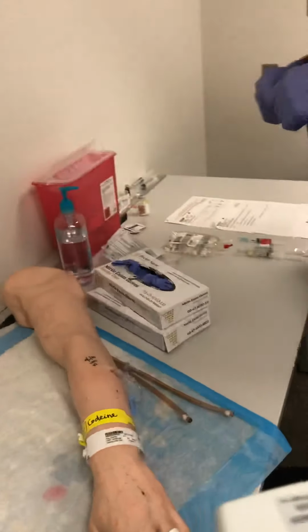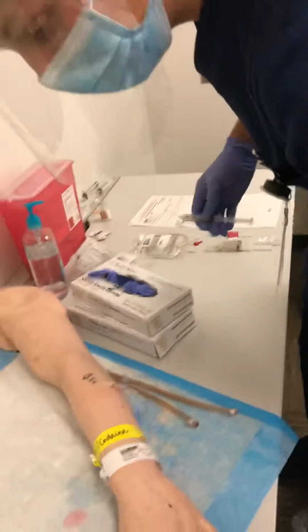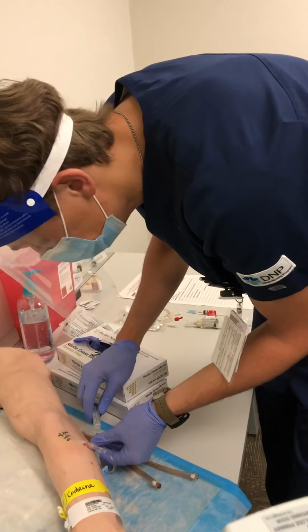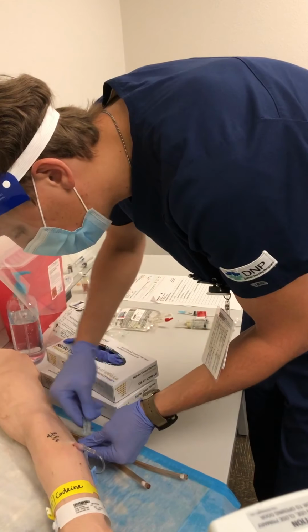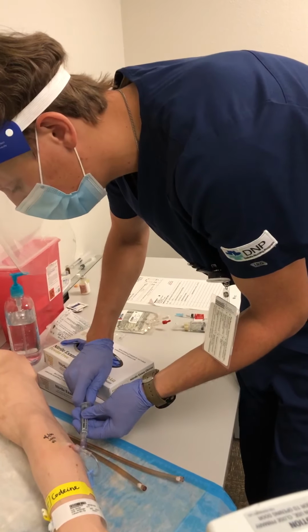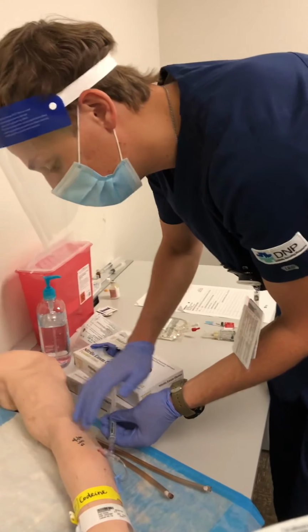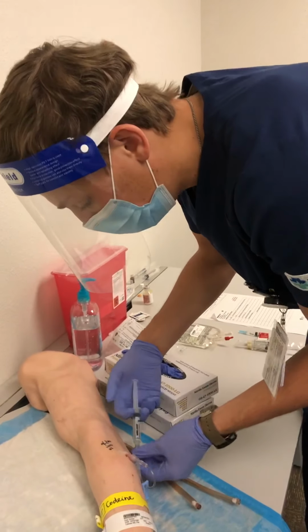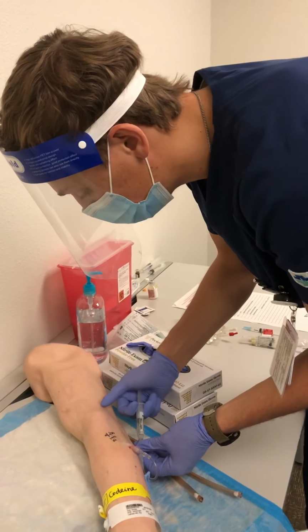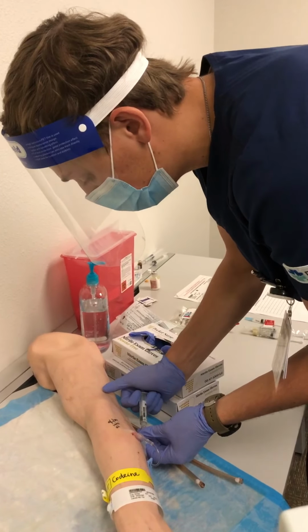And then before I ever instill medication, I want to flush it with a saline flush. And then on this first one, I want to be able to pull back and see blood return. That way I know that this line is patent, and then I can go ahead and instill the 3 mils of saline.